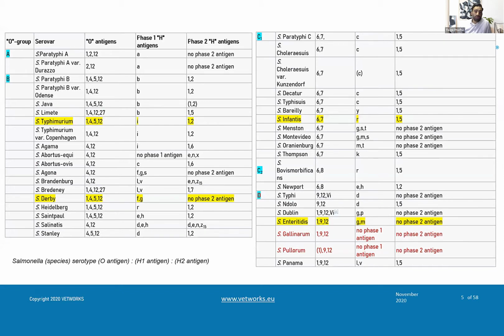Okay, this is a list of different strains that we have for Salmonella, depending on the antigen that they have on their outside surface. Like I said, this classification is a phenotypic classification, and we do a test for this serotyping classification, which I will cover, which is basically a test with specific serum that reacts with the Salmonella and allows agglutination of the strains and allows us to understand which strain we have. And then we have these different strains that we have here on the list.